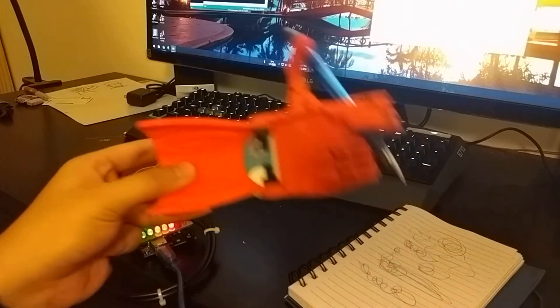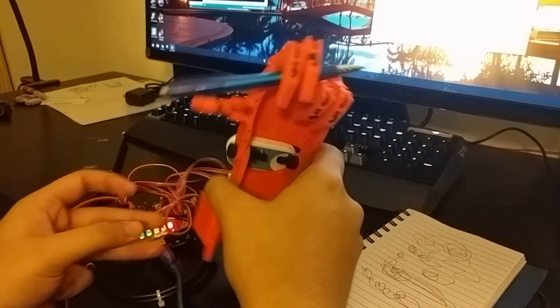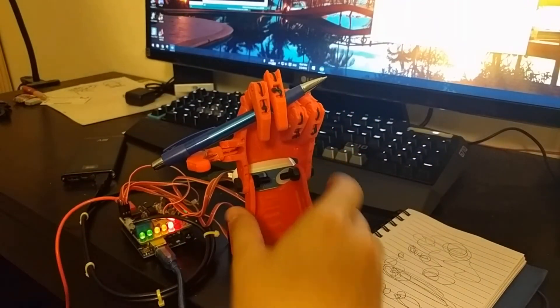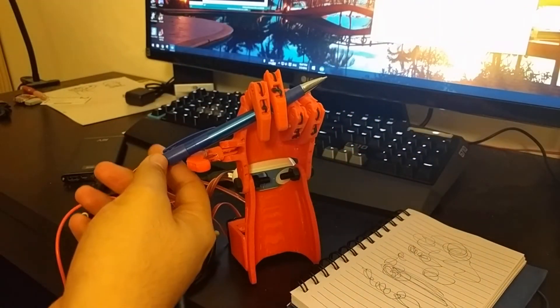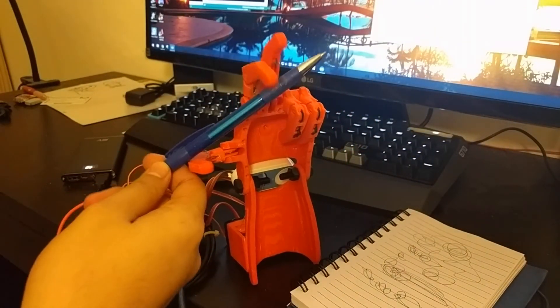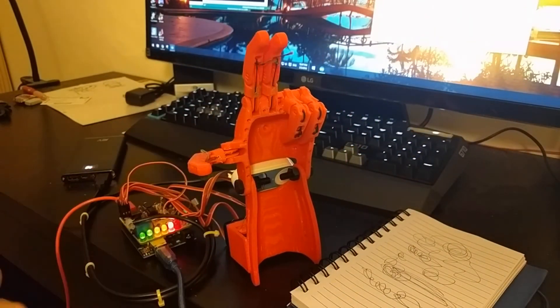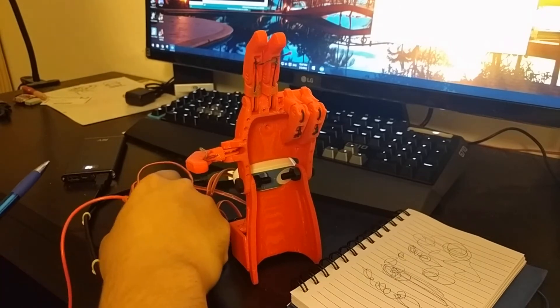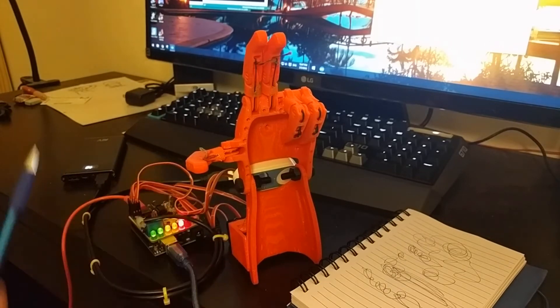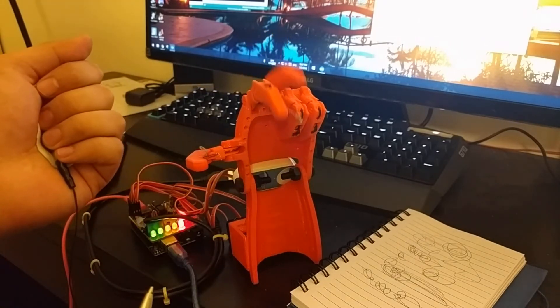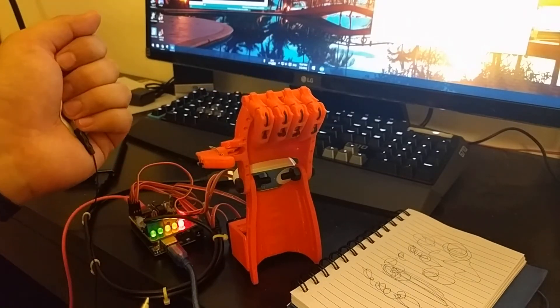It can also write very smoothly. Open the hand, I change it back to power grip mode.